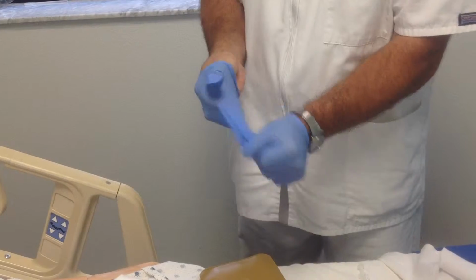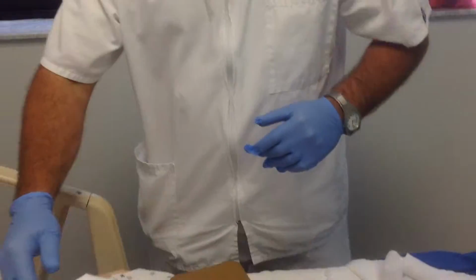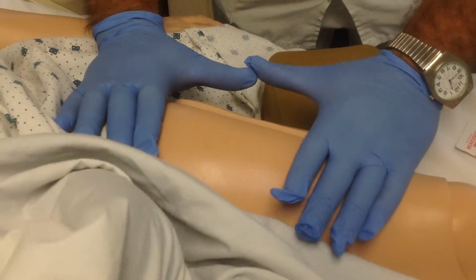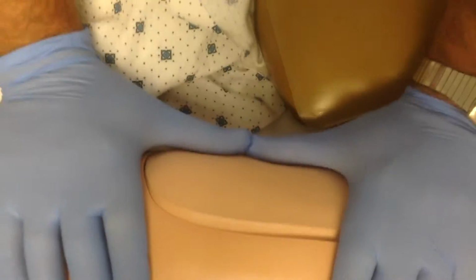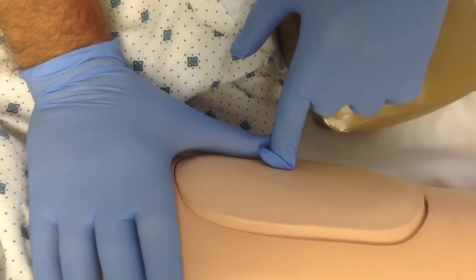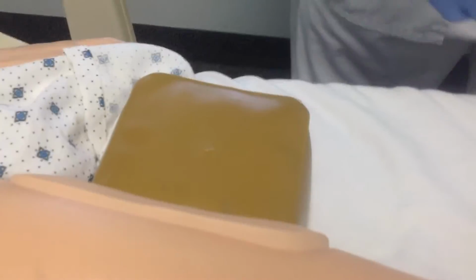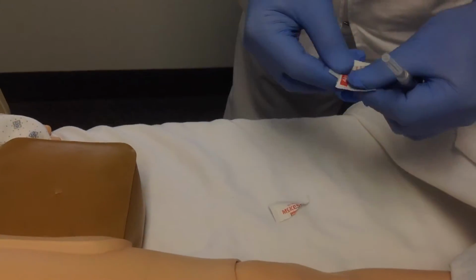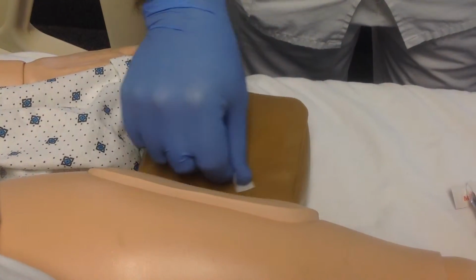Alright, so we're going to go ahead and go under the trochanter and divide into thirds, above the knee and divide into thirds. And you see that area right there, just above my thumbs, would be where we would be giving the injection. Okay? We're going to get ready to give the injection. So first I'm going to wipe, starting around the selected area and working my way out.